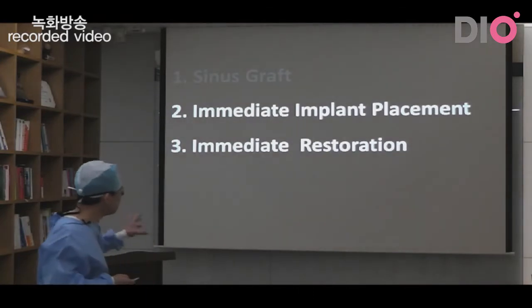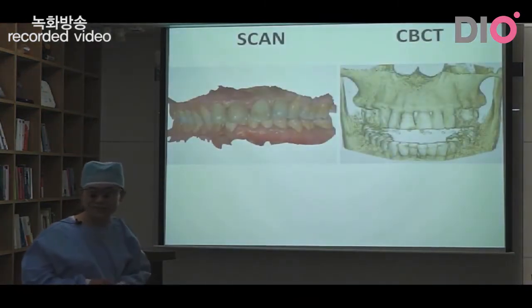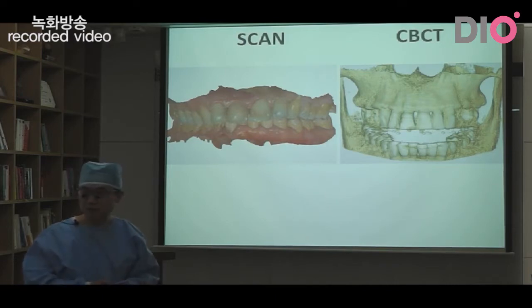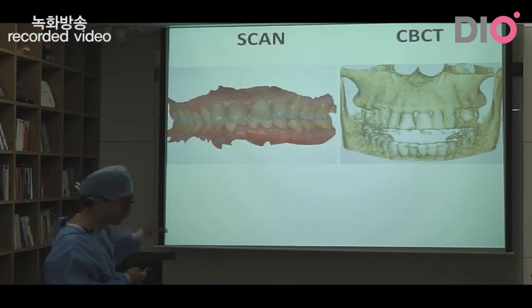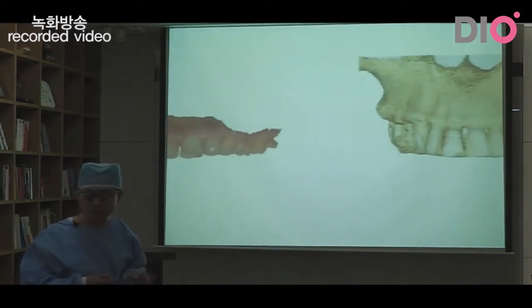For the immediate implant placement and immediate restoration, I took two digital images. The first one is the oral scan image that was taken by Trios. And then the other digital image is the cone beam CT scan image. Both images were merged.